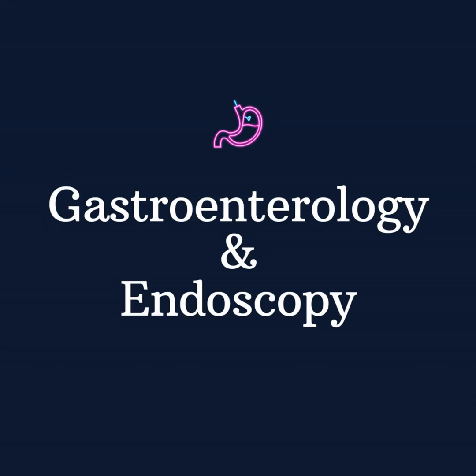Welcome to today's podcast on the endoscopic resection of a laterally spreading tumor, LST, in the ascending colon. We will be discussing a case where a flat polypoid lesion larger than 10 mm was identified, classifying it as an LST. The initial steps for planning an adequate resection include determining the lesion's location, which in this case was found between two folds. The morphology was analyzed and identified as LST-granular.